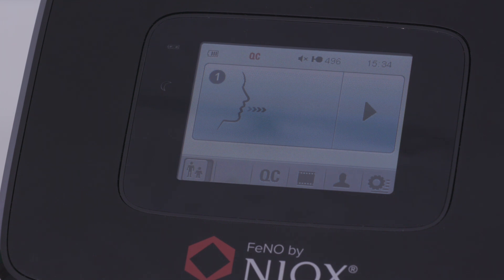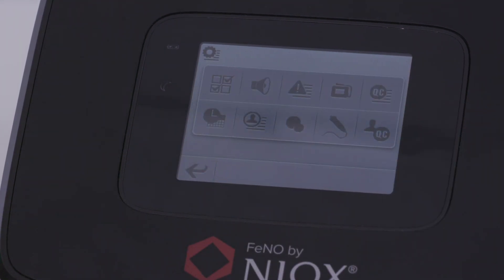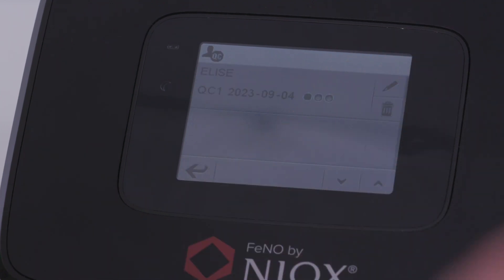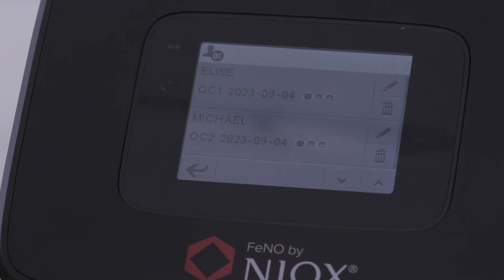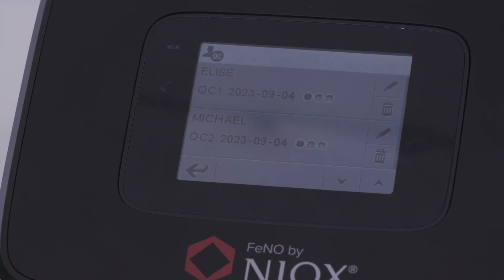To check a QC user status, touch the settings icon on the home screen and select the QC user icon. This section will show if the person is either qualifying or qualified. Qualifying is when one or two green dots are present, and qualified is when all three dots are green with a number average.